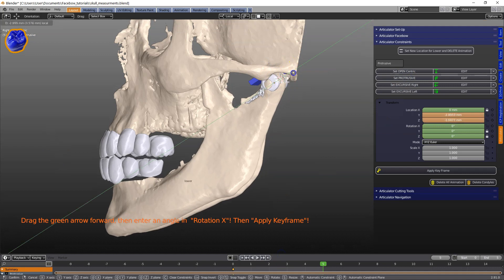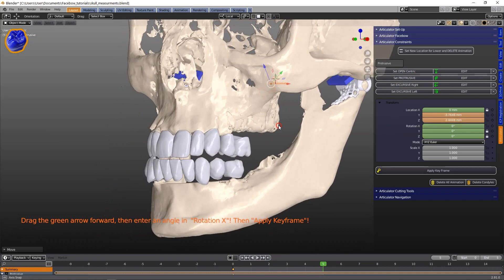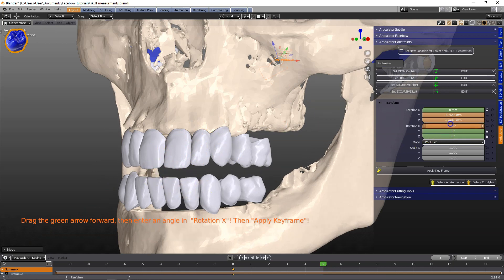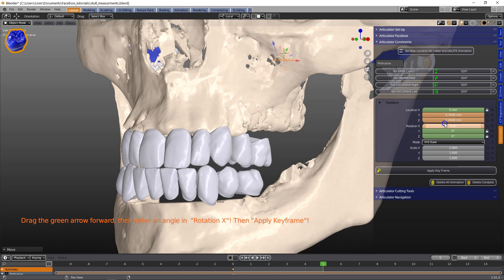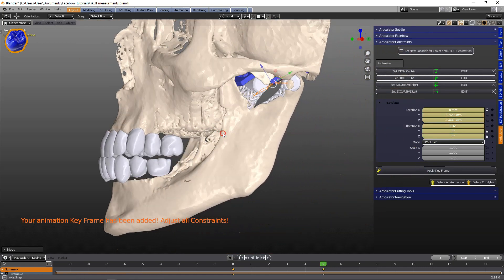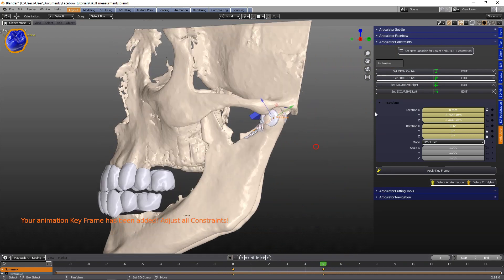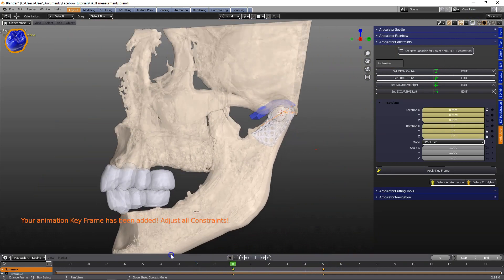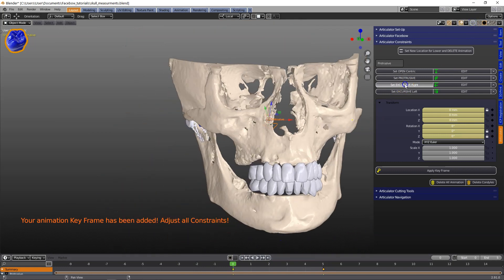Then I'm going to do the protrusive and close the bite a little bit as well. If these were the patient's teeth we could set it exactly into the wear facets. Then apply the keyframe and the animation has been set. From the side view you can see how the jaw moves down.